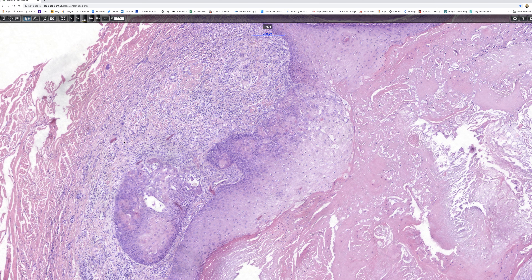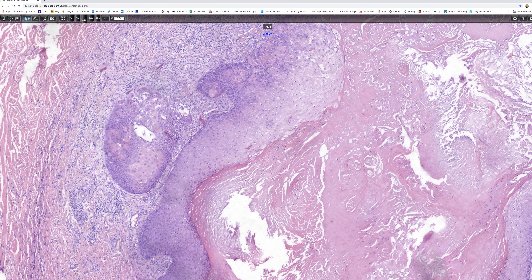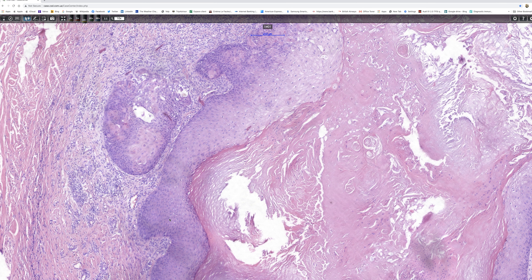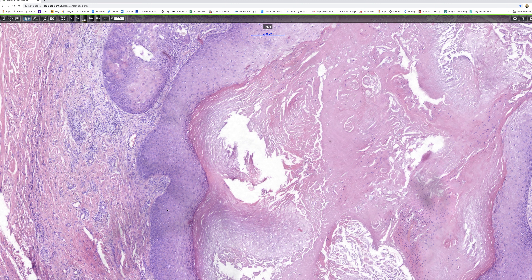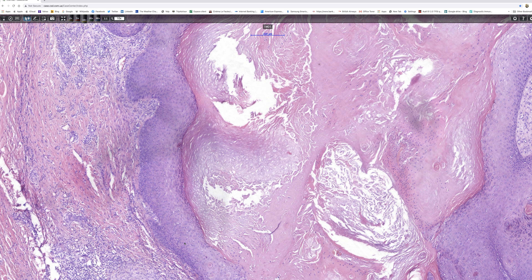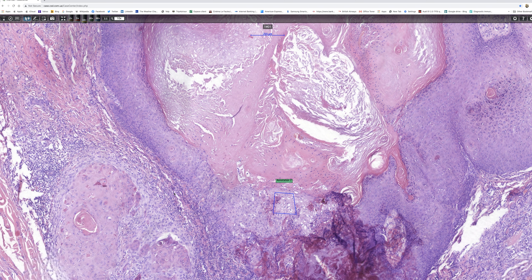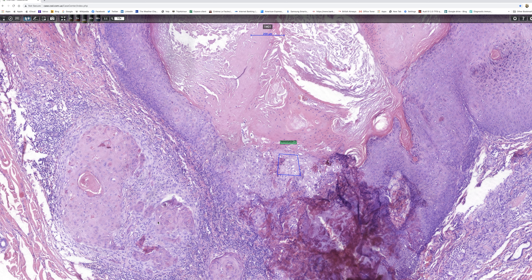And if we follow the cyst wall around, we can see there's a pretty heavy lymphohistiocytic infiltrate around the cyst wall. It's probably been ruptured at some point, and if we had enough levels, I'm sure we'd find a foreign body giant cell reaction. And in fact, there's more of the cyst wall showing squamous eddies.